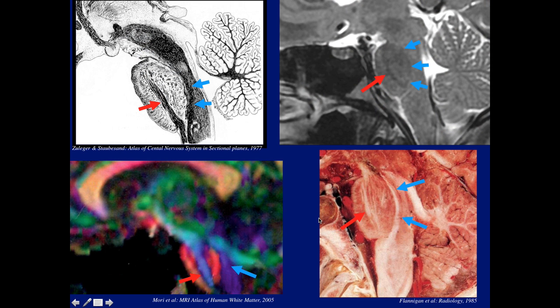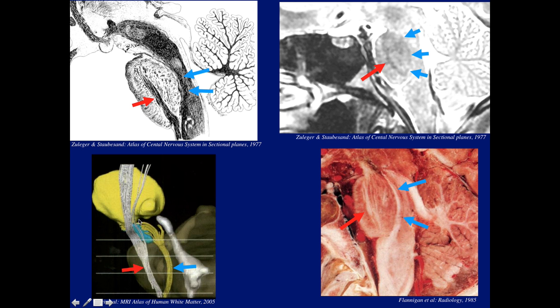Here it shows both: anteriorly the corticospinal tract and posteriorly the medial lemniscus — as shown on the specimen and nicely on the anatomic specimen. On sagittal tractography, here is the corticospinal tract and the medial lemniscus — motor and sensory, which is why I colored them different colors. This is tractography from the literature: corticospinal tract and medial lemniscus.